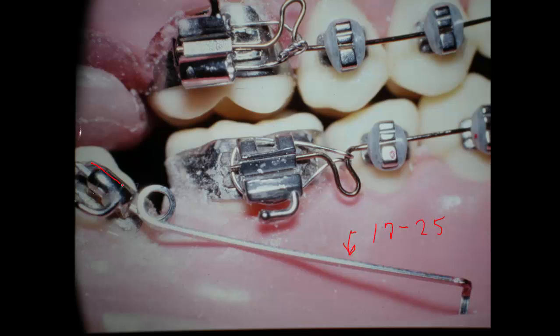You have to bond a little tube or something on the side of the tooth, and this allows you to insert a spring like this going in, and it just makes a simple little loop and comes back out. And this is about as much activation as you can try, because you have to fit it into this little tube, and a lot of times we'll smooth the end of it down here so it'll slide in there easier.